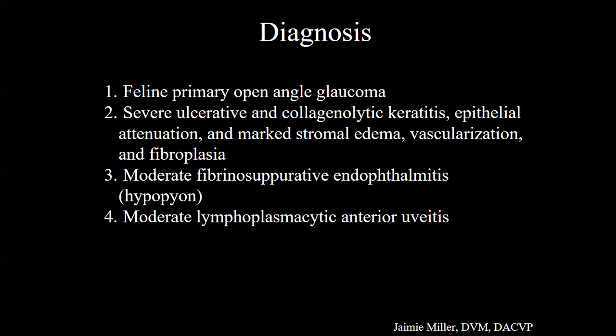Cool. Are we sure they're epithelia and not some hypertrophic wonky endothelia? Yeah, I think so. I just glanced at them. It sounds like you guys spent more time on this. There were a few that looked very keratinized. Okay. Yeah, and large, but that would definitely be a differential. And who knows? It's a cat. Attenuated corneal epithelium, so potentially herpes virus at some point, and try to blame everything on herpes virus.